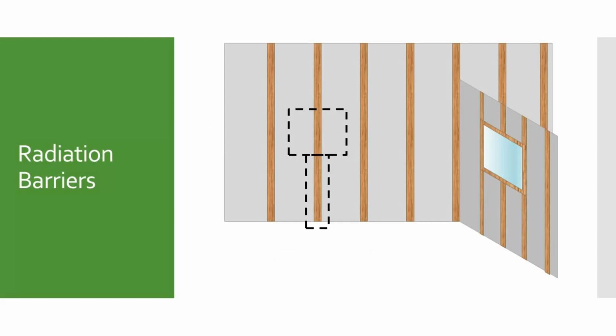In the construction of this radiography room, we will identify the primary and secondary barriers and discuss the methods for creating a safe environment for technologists and those walking and waiting in the areas just outside the radiography rooms. As you can tell from this drawing, we have a wall already designated where the upright bucky will be. We also have a wall for the control area where the control panel will be housed. Which one is the primary barrier and which is the secondary barrier?